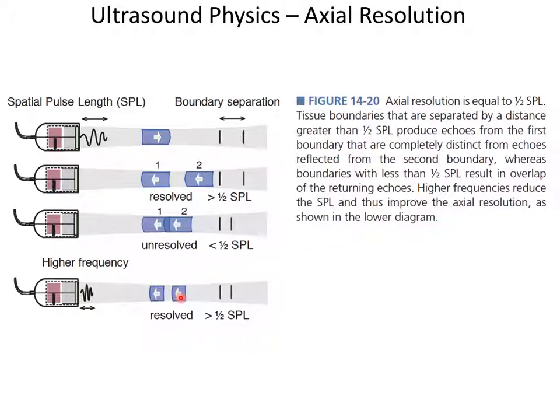And very high frequency ultrasound for high resolution imaging has been used, for local things, small fields of view. You can actually put an ultrasound transducer on a catheter, stick it in the body, and lay it up against stuff, and then make a picture of what's right up against the catheter. We're not going to do it in this course.